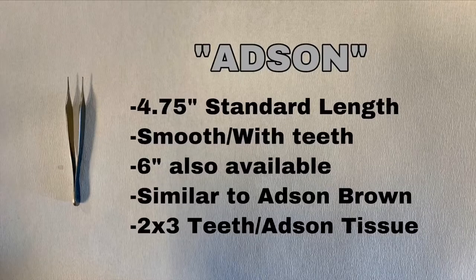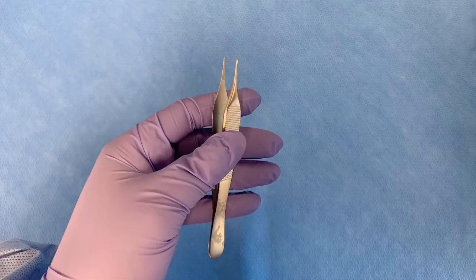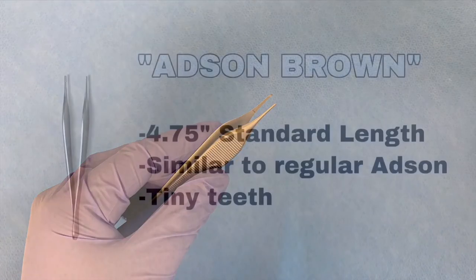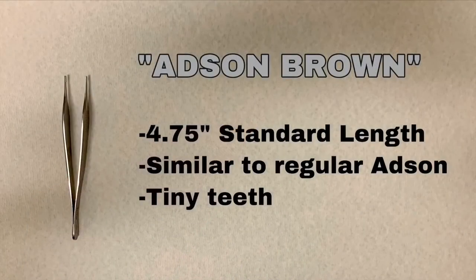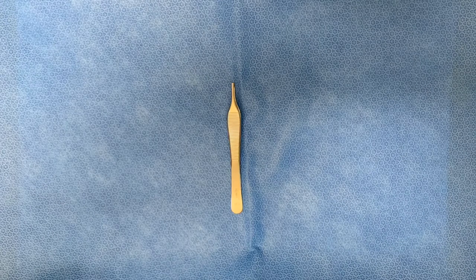This is the Adson forcep, the most common forcep in the set. It is almost five inches in length — six inches is also available — and it comes in smooth or with teeth. This is similar to the Adson Brown. The Adson Brown is also almost five inches in standard length, and you can easily identify it by its unique characteristic of having tiny teeth.